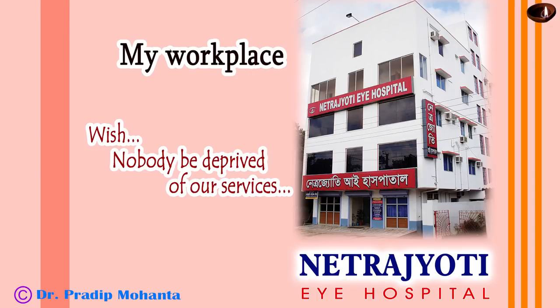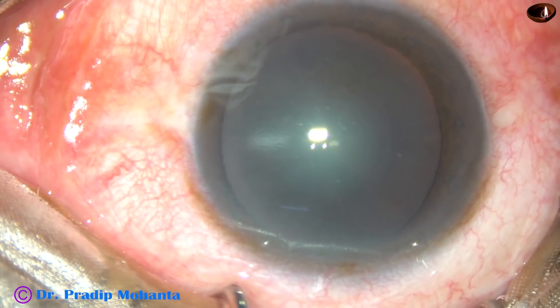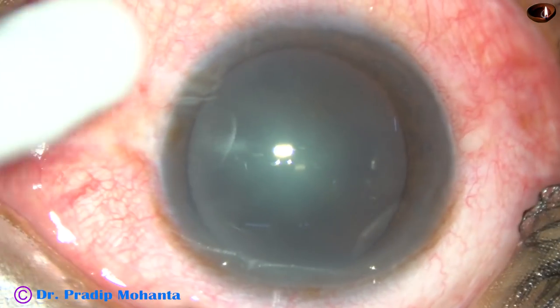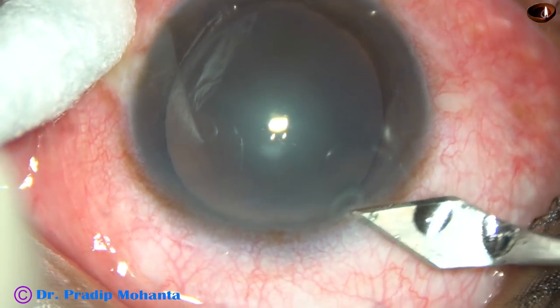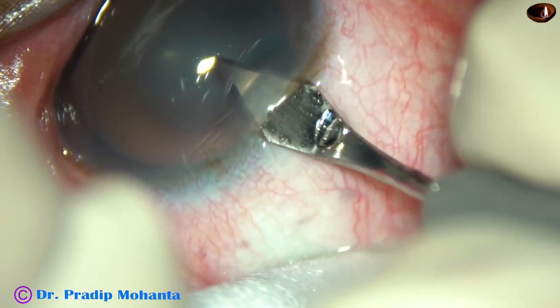Friends, welcome to my workplace at Ranaghat, West Bengal, India. In this video, I want to show my lens tilt technique for soft cataracts. You can see this is a soft cataract — nucleus sclerosis in this case is grade 1 or grade 1 plus.